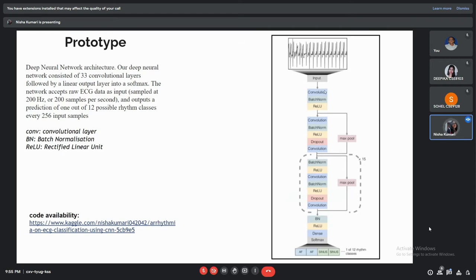So we can see the convolutional layer. The convolutional layer's filters are where the filters are applied to the original image or to other feature maps in a deep convolutional neural network. So this is where most of the user specified parameters are in the network. Then comes batch normalization and the activation function. Basically, batch normalization, rectified linear unit, dense layer, etc.